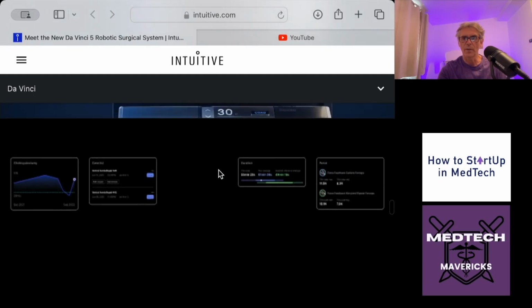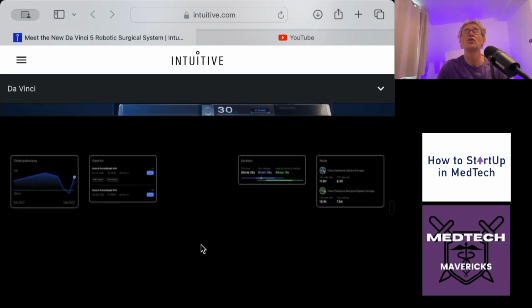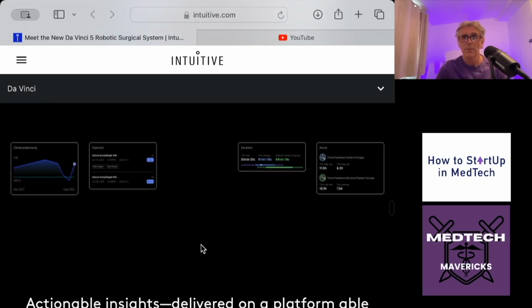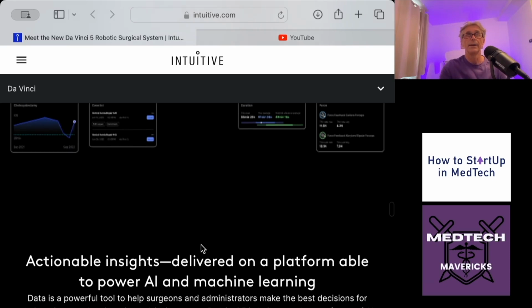Right now, they're going to talk about actionable insights. That's the next thing about this. They've got this 10,000 times computing power, a little bit of marketing. Everyone's computers have gone up by a few thousand fold. Basically, there are tons and tons of data points being thrown off, and now you've added a load more because you've got things like insufflation pressures that can help you understand abdominal volumes and all kinds of stuff. All of that comes in through the hub, the console and the tower, and everything goes up to the cloud.